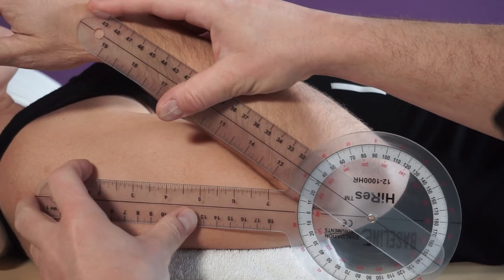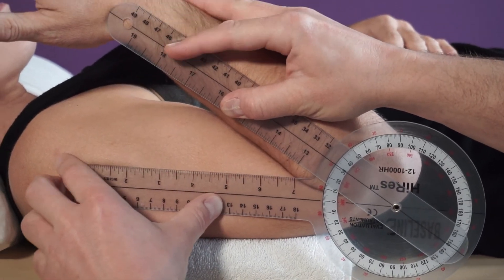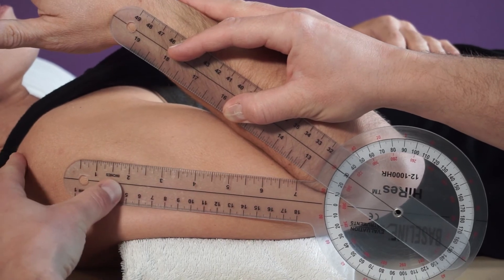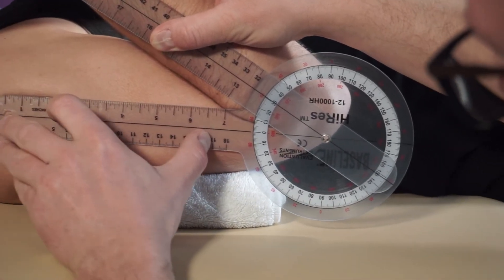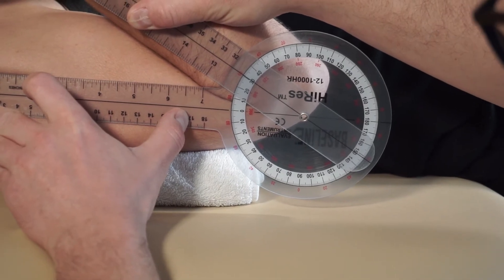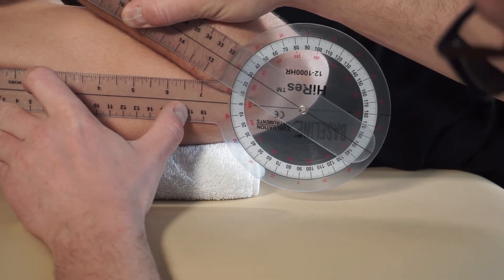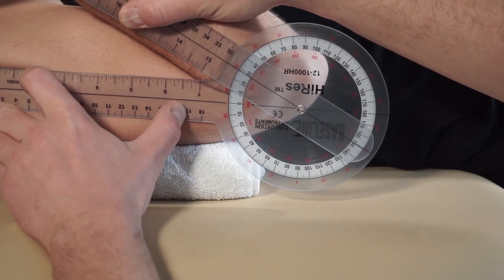You can actually slide the fulcrum down a little bit as long as you're parallel to the bones — the geometry is going to be the same if the fulcrum has to move a little bit. Don't be digging in on that skin. Here she is at 148 degrees of elbow flexion actively. I'm going to push — we are at that firm end-feel — I'll give her credit for a few more to 150 degrees of elbow flexion.